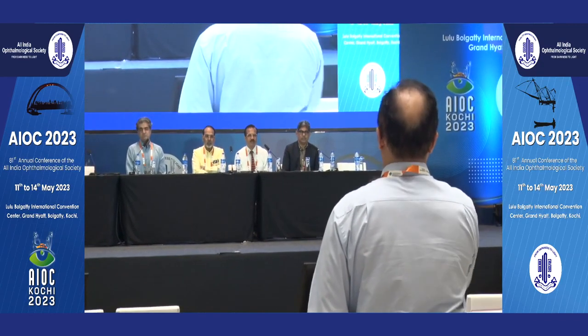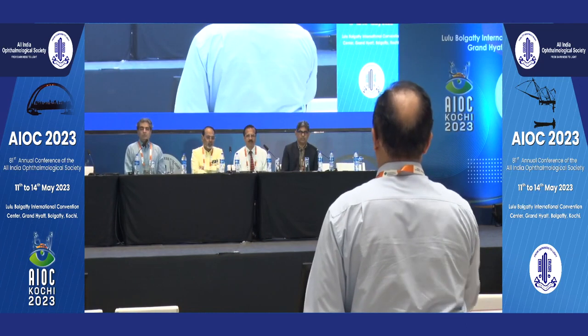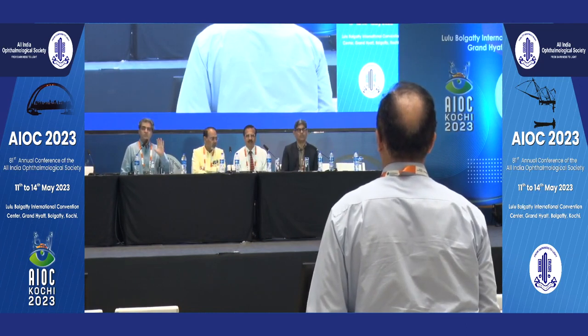But when you're uploading the image onto the Callisto, is there any indication that this particular image is not going to register? Is there a readout or a warning that comes up? No, there's no warning. You just have to look at the photograph.